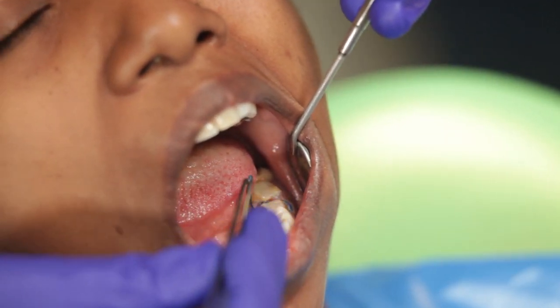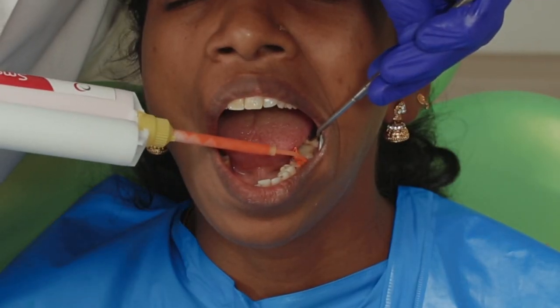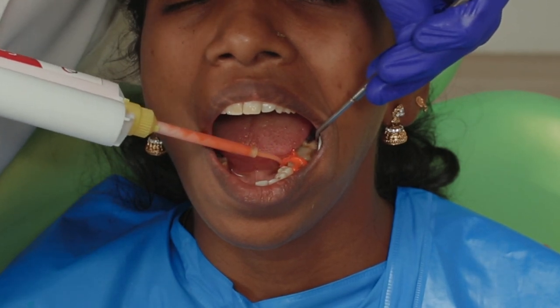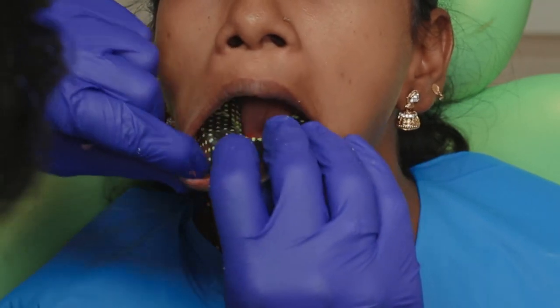I now have the light body ready, and again the top cord comes out and I express some light body into the sulcus and around the prep. I will also place some light body along the occlusal surfaces. In goes the tray and we wait for the material to set.